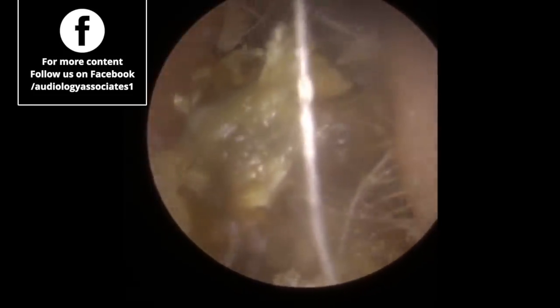Sometimes you are lucky and the whole thing will slide along the canal wall. You can see just how tough that is — how much pressure you have to put on the Jobson horn into that wax. It is starting to move now, just edging towards the outer part of the ear canal. You can see a nice big chunk has come away there.